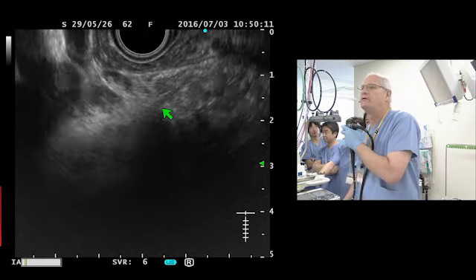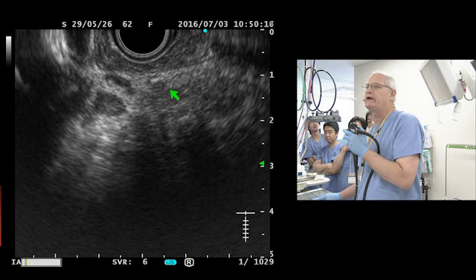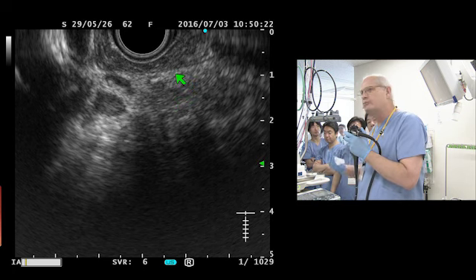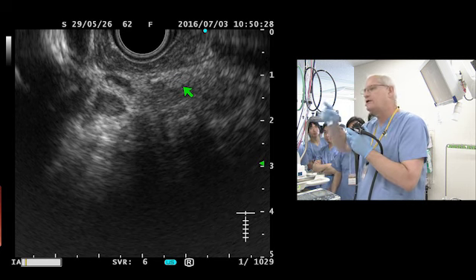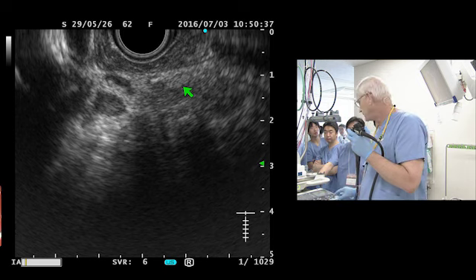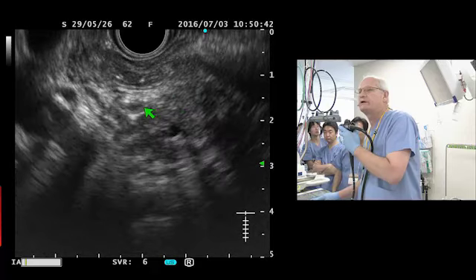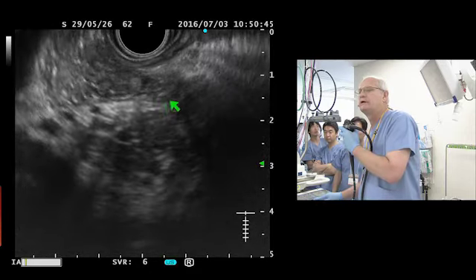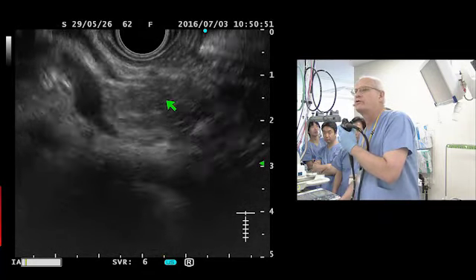And you can see here that it becomes narrowed. Freeze it. And you can see this area of fibrosis, or I should say of echogenic material. I cannot prove it, but it is my impression that a halo, an echogenic halo around the bile duct in the intrapancreatic portion is another criteria for chronic pancreatitis. So you can see the bile duct here narrows as we go through the head of the pancreas. And I think, again, is another criteria for chronic pancreatitis.